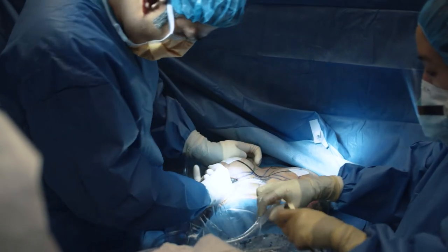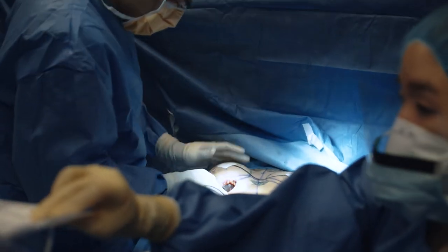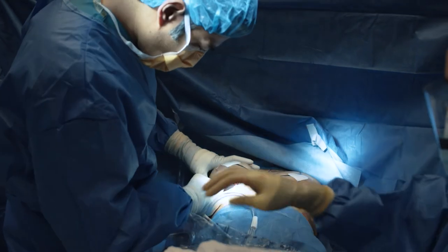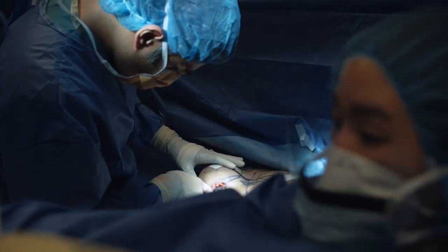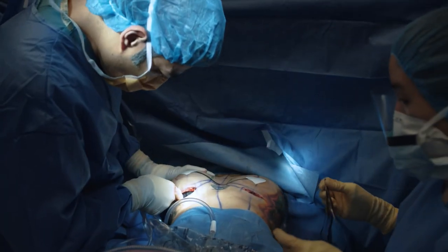Now we finish our final dissection. Just like that. Make sure the implant is sitting properly. Adjust the implant.